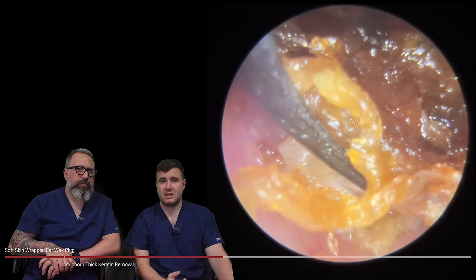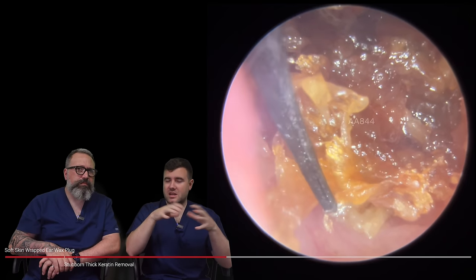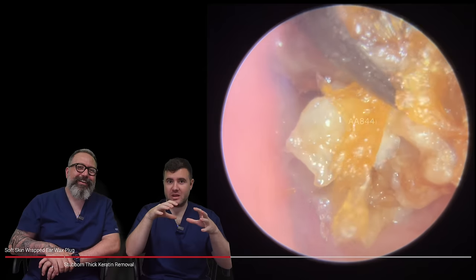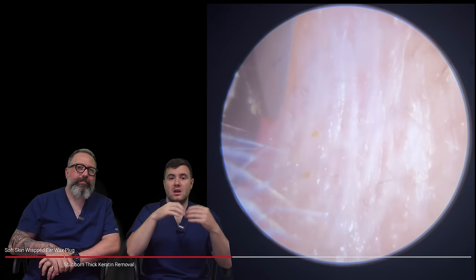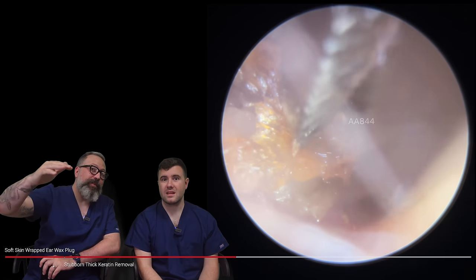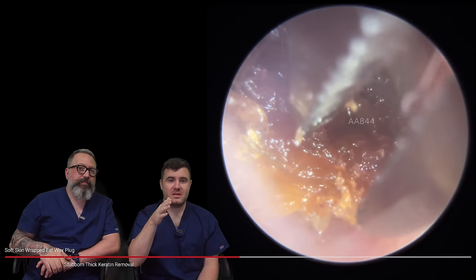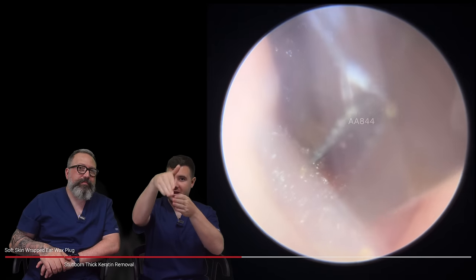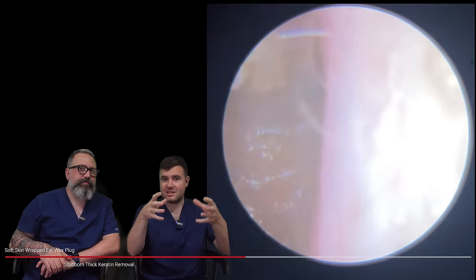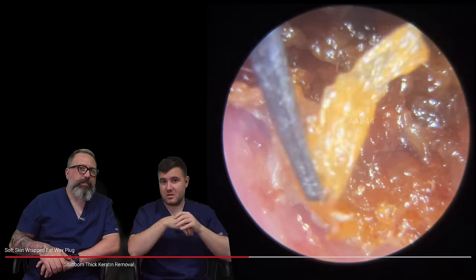There we go, we've managed to just get underneath it. Throughout the whole process I'm constantly checking in with the patient, especially at moments like this — are you okay, how are you feeling? That was a perfect angle to get a grip with the forceps there, but it just goes straight back down again. The problem is when we go in with these tools we have to go in above the camera, so you almost want to go in from the bottom rather than from the top, but it's almost impossible to get a decent view that way.